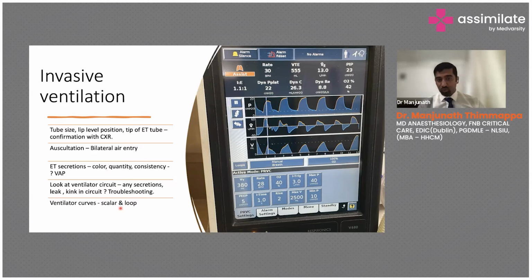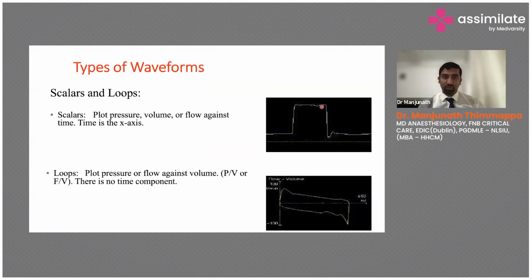We should also be aware of the ventilator curves. So we will go with that: the types of waveforms, the scalars and the loops. Whenever you're dealing with a patient on a ventilator, you should be aware of the scalars and the loops. I'll not go into detail.